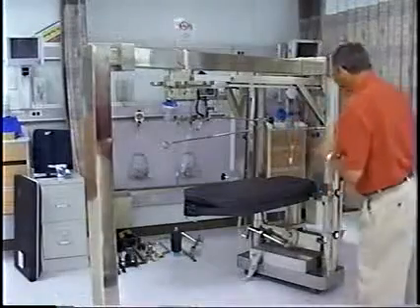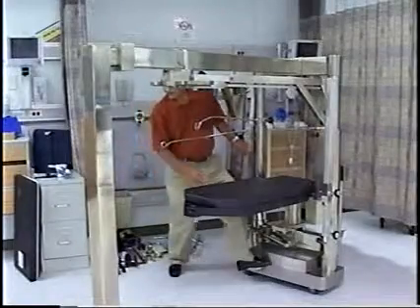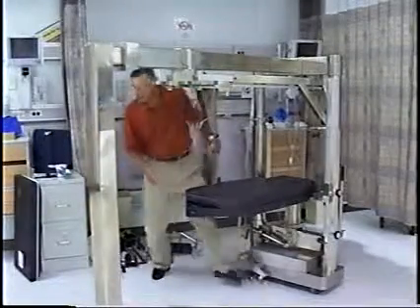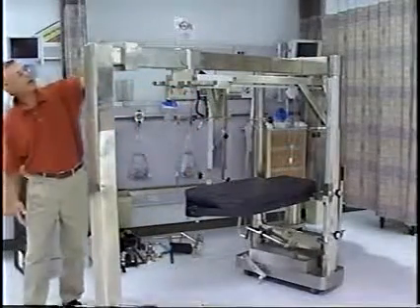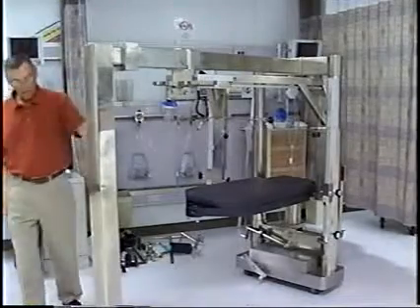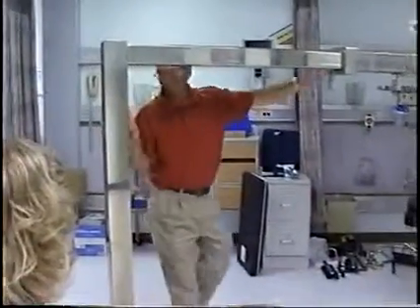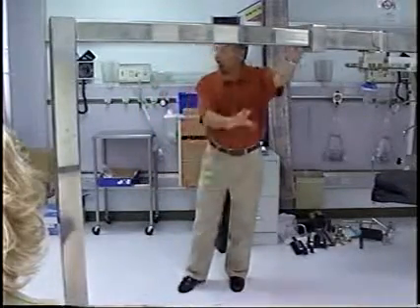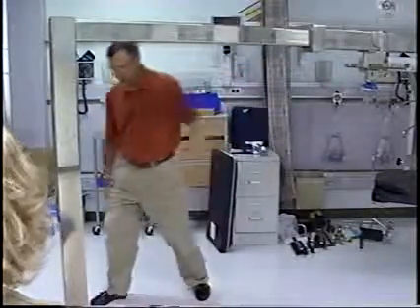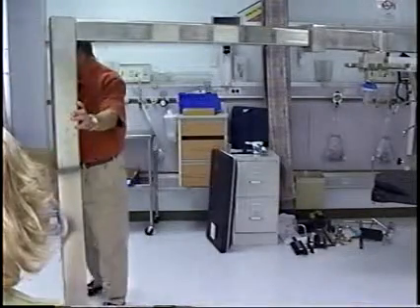Assuming you've done that, first thing you do is to lock the head end of the table. Once that's locked, there's a knob here that says lengthen and shorten. Then the whole end of the table can be pulled out, and it should be pulled the entire length. And then we lock it down, and we lock it down tight, because we're going to be pulling traction against this end of the table. Then we lock the foot end of the table. And these brakes are not real secure, but they'll hold.